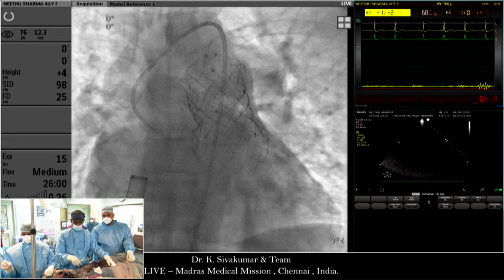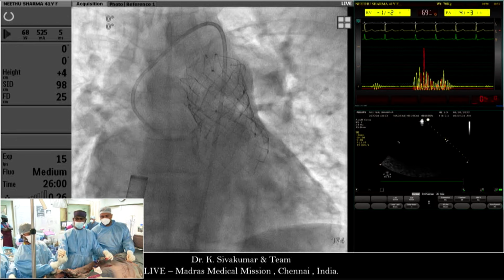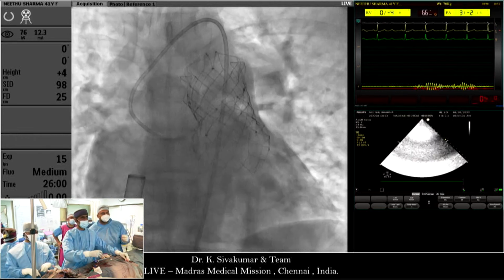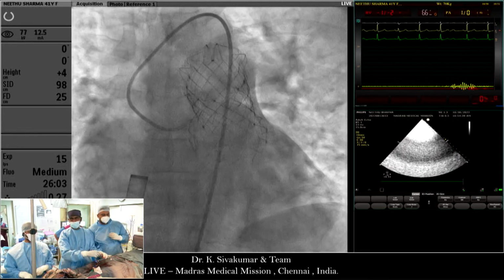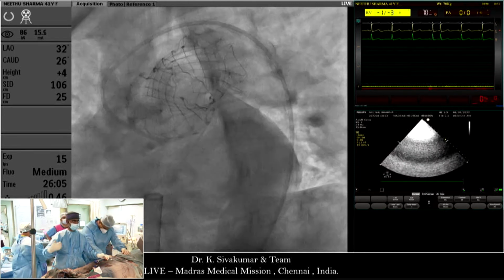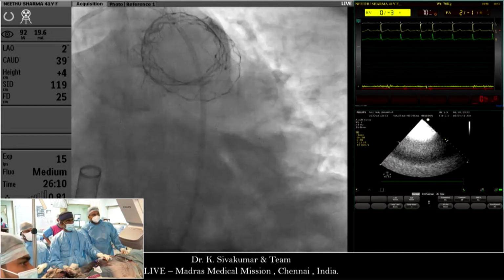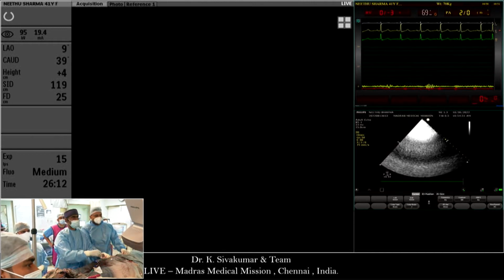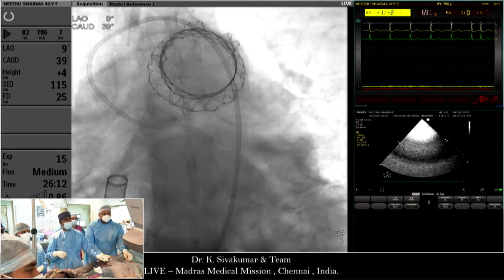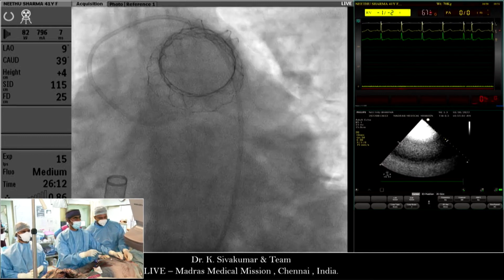Shak, let me ask you, have you seen any coronary compression in native RVOT until yet? So I've got one patient, not native RVOT, who was post-Ross, with translocation of the coronaries at the time of surgery, with a risk of coronary compression. Yeah, we have seen it only in those patients with coronary abnormality or any transfer of coronary, such as Nikaido. Otherwise we haven't really seen it.